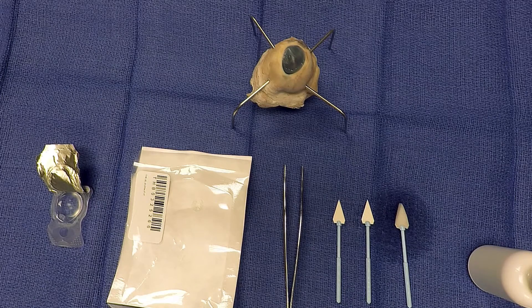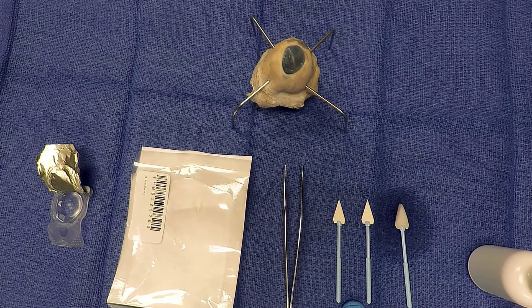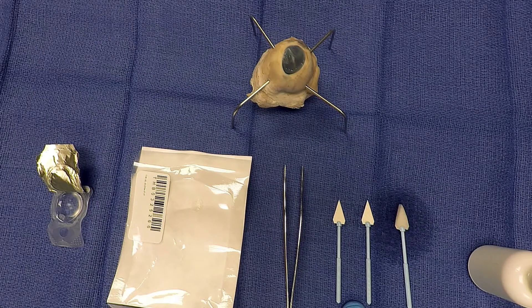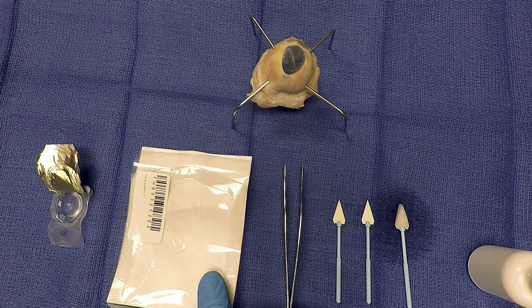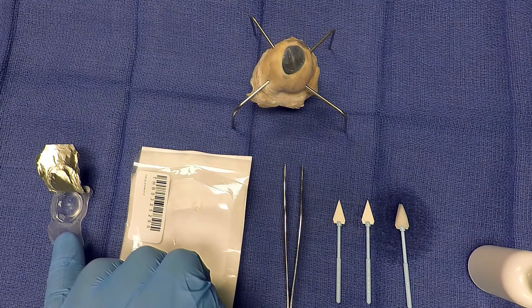The items suggested when performing this procedure in clinic are the anesthetic drops, a soft cell sponge to dry the ocular surface for better adherence of the membrane. This sponge can also be used to dry the bandage contact lens before application over the membrane. Smooth tip forceps to allow for easy placement of the amniotic membrane, the Eclipse Amniotic Membrane, and finally the bandage contact lens.